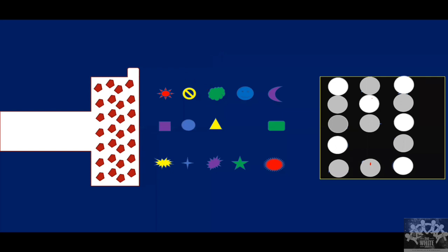So if I see this brightness, I know that there is some calcium or a stone here. If I see this level again, I know there is some calcium or stone. This might be a bone, or this might be a stone. So this brightness tells us what the different structures are. That's how we get a B-mode image.